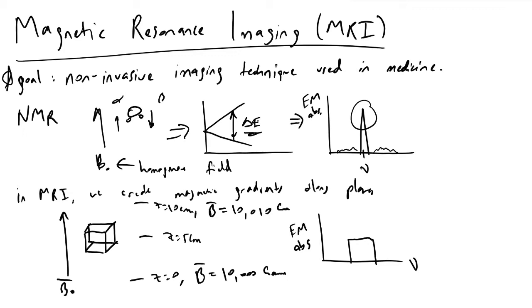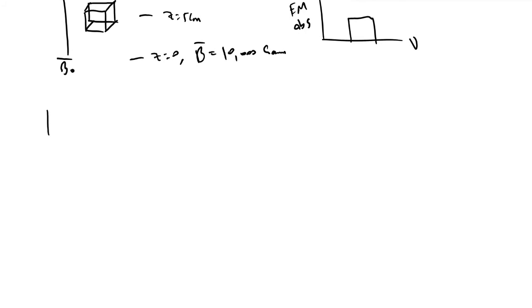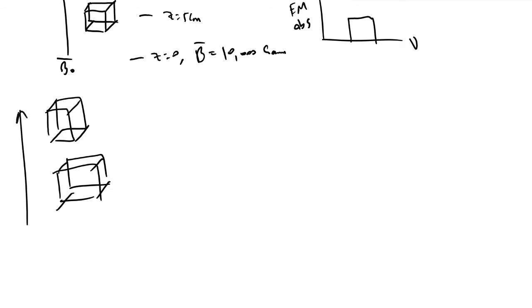And so based on this principle, if we extend this from the single dimension case into multiple dimension cases, what we'll find is this. So let's say now we have 2 blocks of water suspended in 3-dimensional space, and we'll be applying some magnetic field in the same direction we had previously. It now will help us to define a coordinate system.